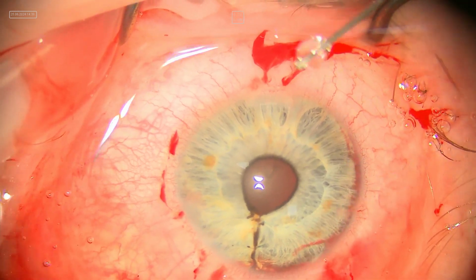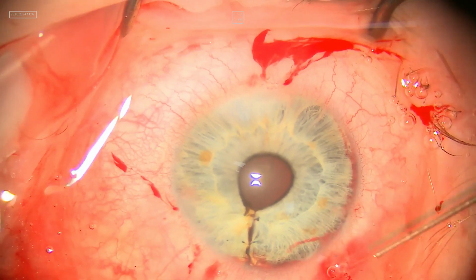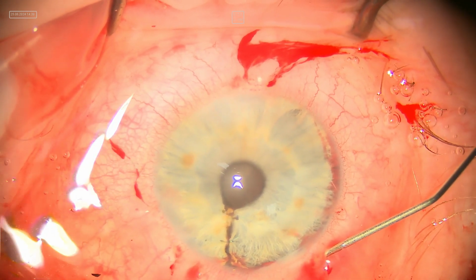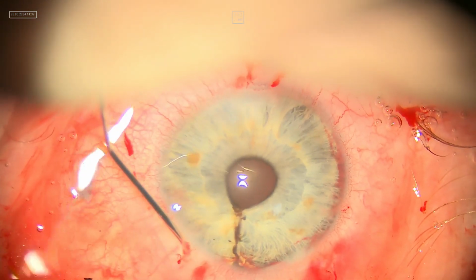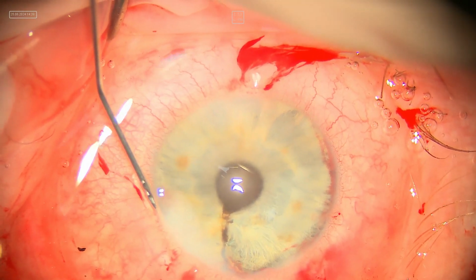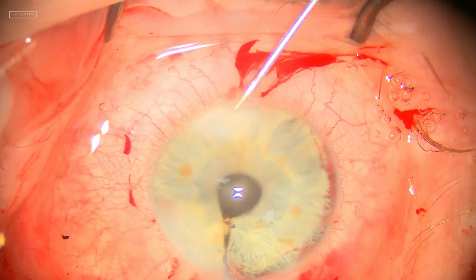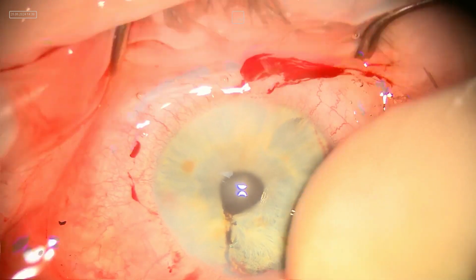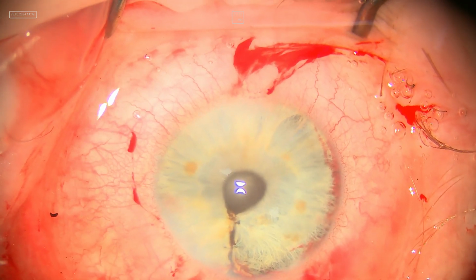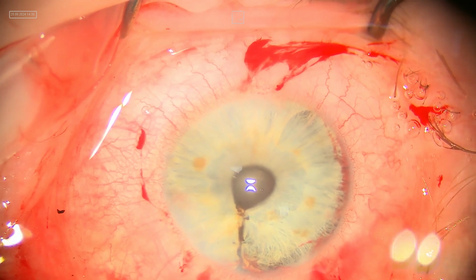During the surgery, I don't want to show you all the stages of the surgery, but only to show you that we can do it. The difficulty of the surgery was the presence of a natural crystalline lens with safe accommodation, and when I do such surgery, I have to be very careful to avoid touching the lens. The patient is very young, about 30, and touching the lens can cause a need for lens removal.